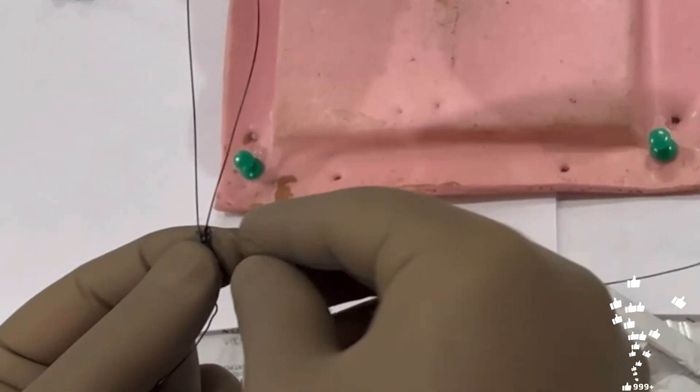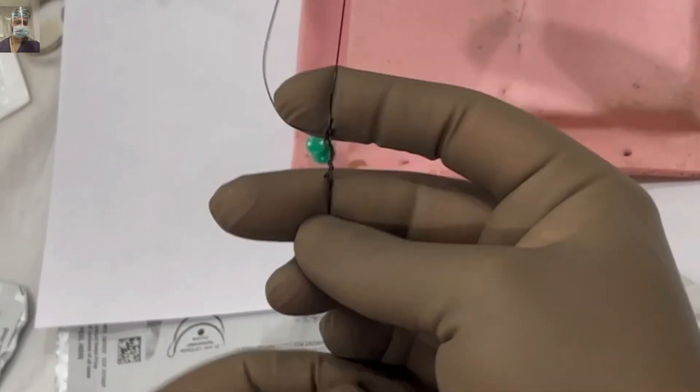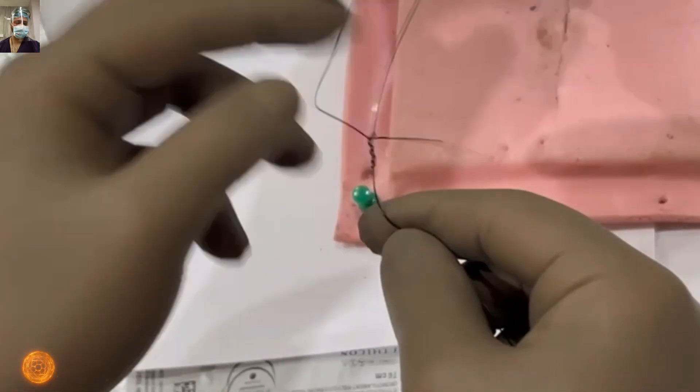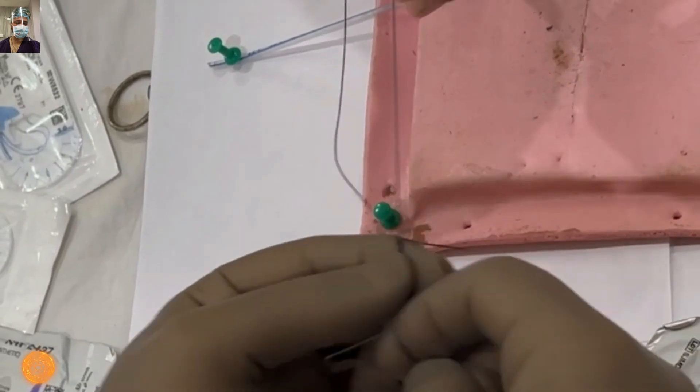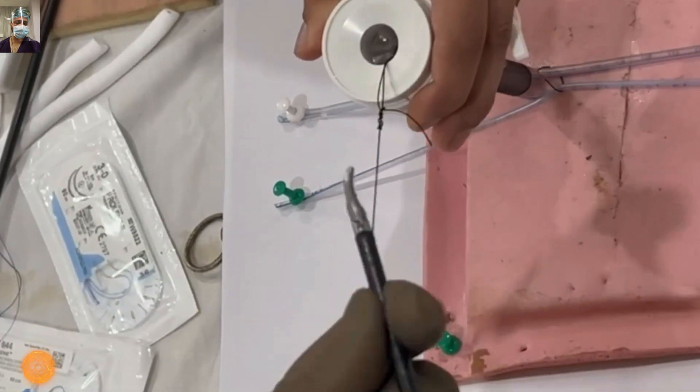Cut the tail end — this will be the short end. Keep it 2-3 cm as desired; 2-3 cm is sufficient. For monofilament sutures you can keep it up to 3 cm. Then slide it and your secure, tight Melger's knot is ready.